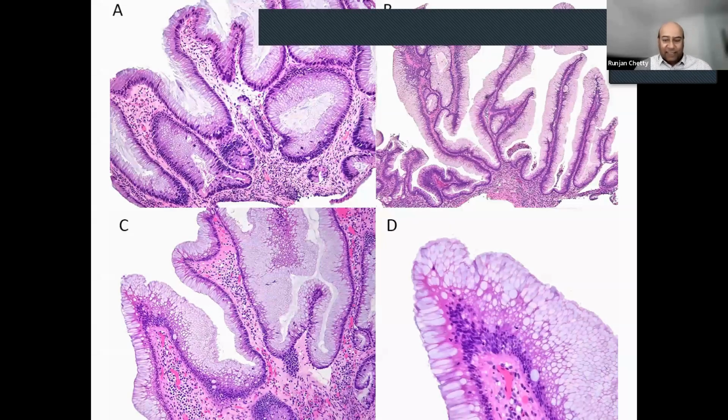Again, out of context, a biopsy like this, you wouldn't call dysplasia because you don't know the clinical scenario. But in a patient with inflammatory bowel disease, this takes on more serious connotations. So again, if we start at the bottom, you'll see that there's nothing here that really would alarm you. It's all basally oriented nuclei, lots of apical mucin, architectural distortion, sure. But this has been shown to be a form of dysplasia in IBD.